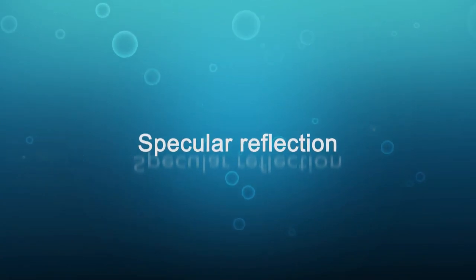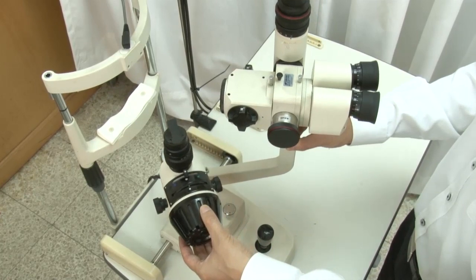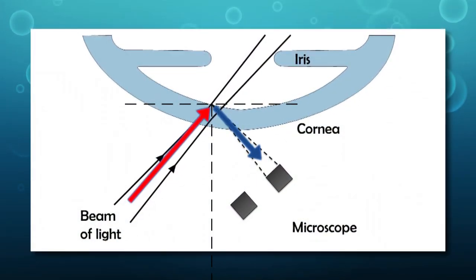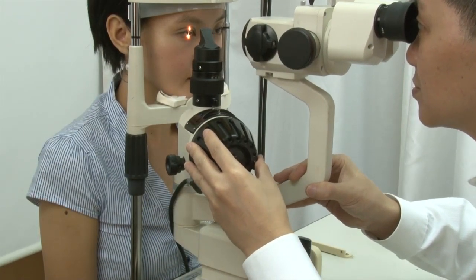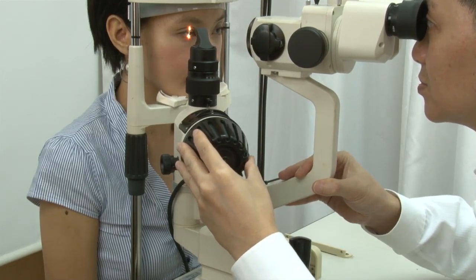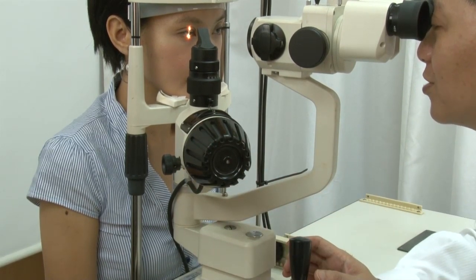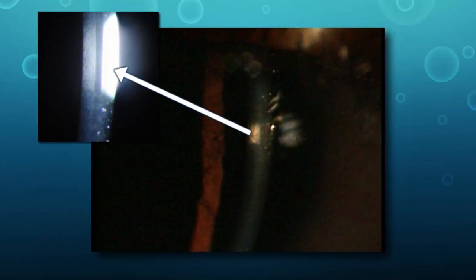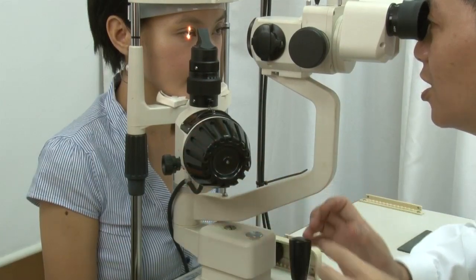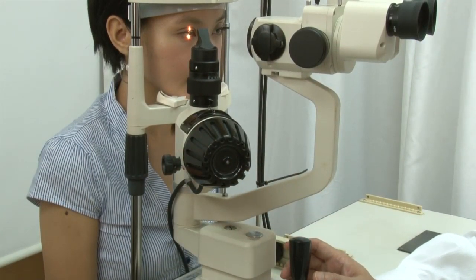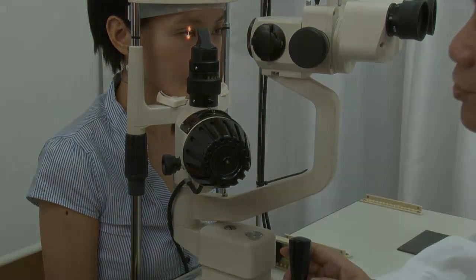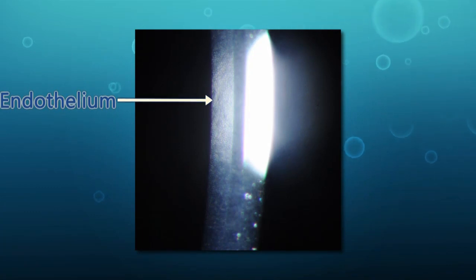Specular reflection: first, set the angle between the light source and the observation system so that the reflection path of the light source overlaps with the observation path. Adjust the slit width to about 2 millimeters, similar to the parallelepiped. Set the light source to maximum intensity and magnification initially to low. A bright specular reflex should appear in one eyepiece. Zoom to the highest magnification — a bright image can be seen with a dull image adjacent to it. Adjust the joystick slightly to bring the endothelium into focus. Specular reflection is primarily used for viewing the endothelium, whose structure looks like a mosaic pattern.